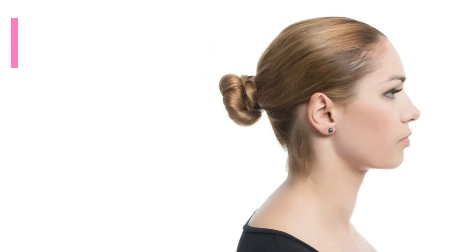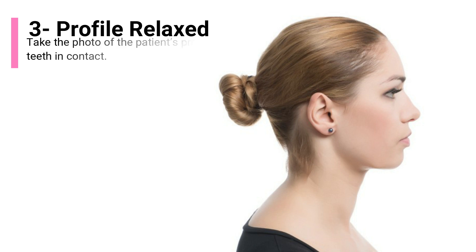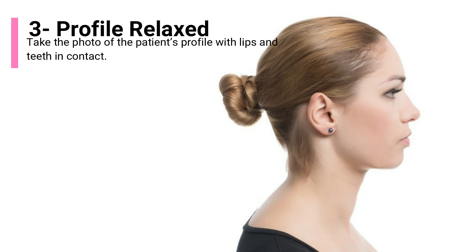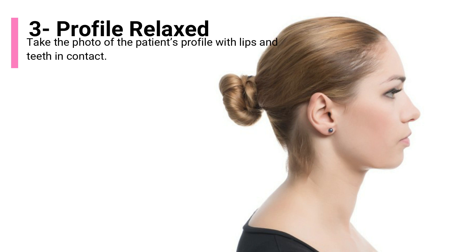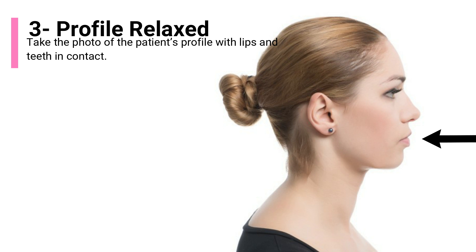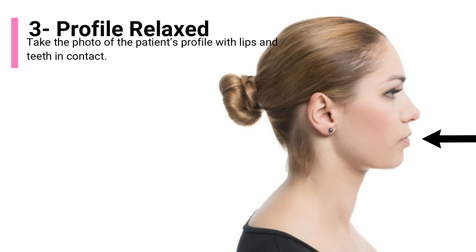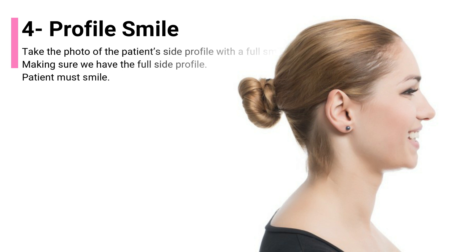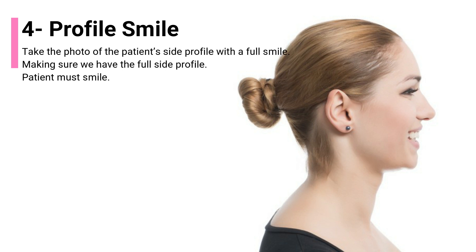The third photo is the profile relaxed. Take the photo of the patient's profile with lips and teeth in contact in a relaxed position. Photo number 4 is the profile smile — take the photo of the patient's side profile with a full smile, making sure we have the full side profile.